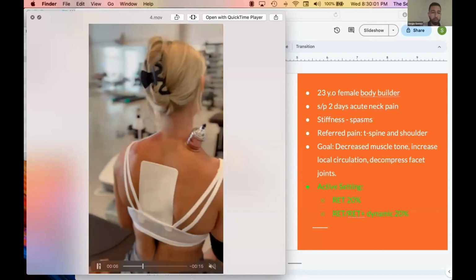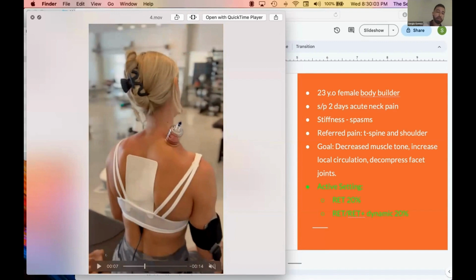I have a unique setup here. The sticky pad, I kept it here the whole treatment for the most part in the thoracic spine. This was my ground plate, and then I did a whole bunch of different things with either my CET when I was working on initially with my CET wands, all throughout the neck, the base of the neck into the suboccipitals, just wanding through for about trying to bring the muscle tone down for about 3 minutes or so.